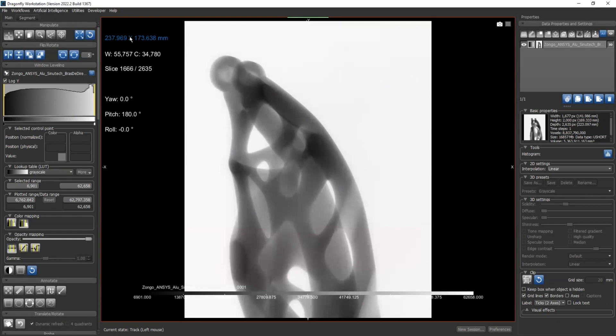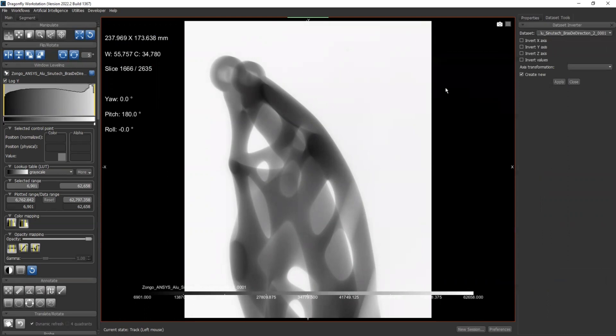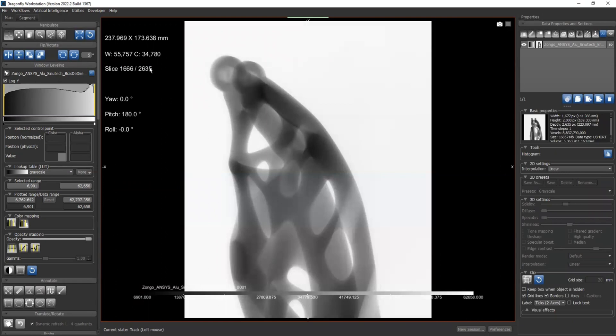If when you loaded your image, it's not on that orientation, you'd have to select your object on the right, right click, go to modify and transform, select invert. Now you could either invert x, y, or z-axis, or do axis transformations, to make sure that you have the same orientation as I have over here.